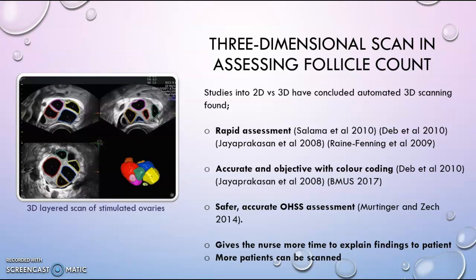Follicle tracking is used to assess the response to ovarian stimulation during fertility treatment. In most clinics, two-dimensional transvaginal ultrasound is used to perform and monitor follicle growth. The reliability and validity of such measurements are likely to decrease as the number of follicles increases. With two-dimensional scan, only an approximation of the actual follicular volume is achieved, therefore it cannot be used to define standards of follicle tracking.